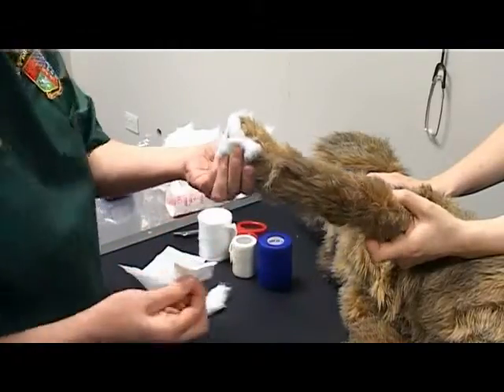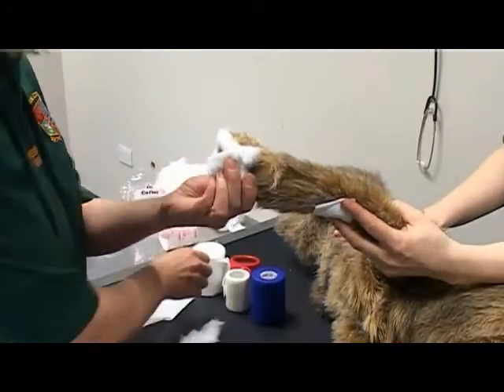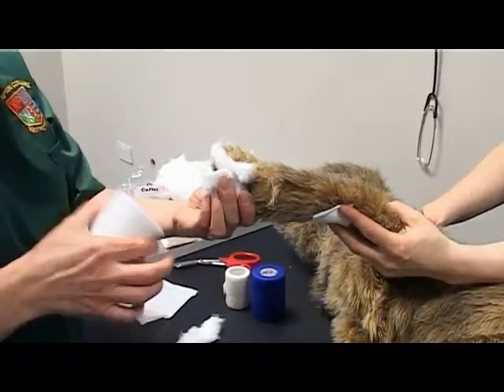Apply the wound dressing with the correct side facing the wound. This is shiny side down. Ensure this is applied aseptically.